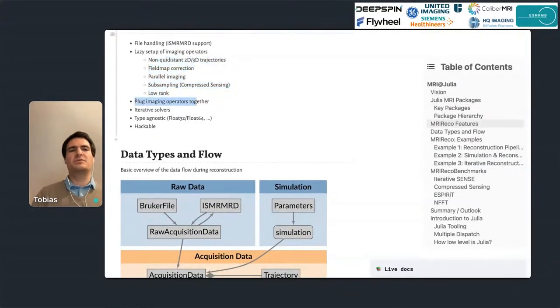But you are not limited to that, because if you have one sub operator, let's call it like that, it's quite easy to build a higher-level or custom one, or some specific imaging operator that looks a little bit different. So it's not that you have just fixed operators, but you can change them on your own. So this is quite easy.